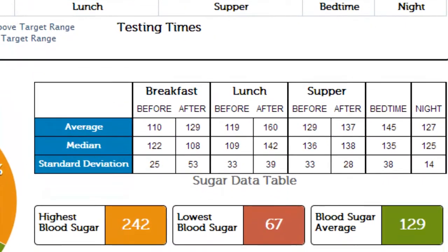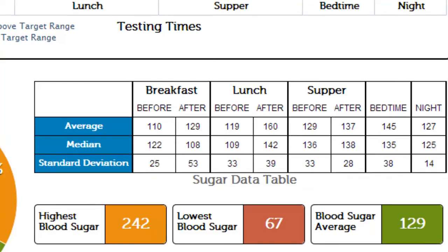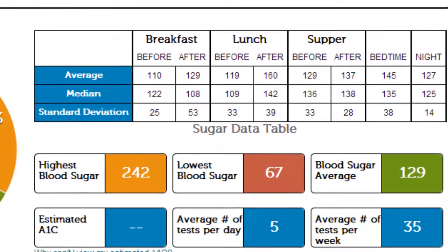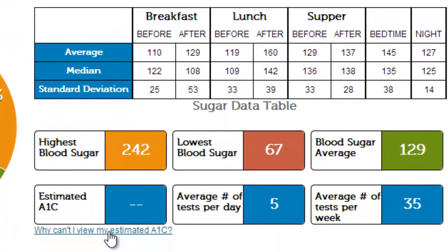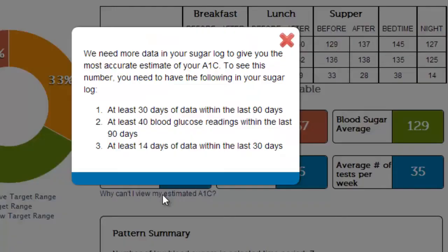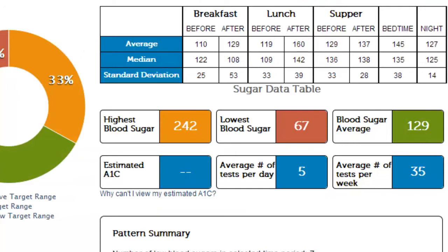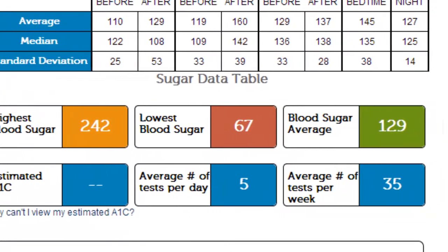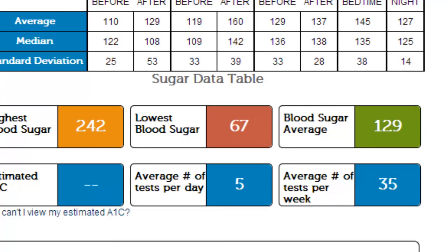Below that, you'll find your highest blood sugar, lowest blood sugar, and your blood sugar average. And just below that is your estimated A1C. This number is calculated based on the last 90 days of blood sugar entries. Here, you will also find the average number of times you've tested your blood sugar each day and each week.